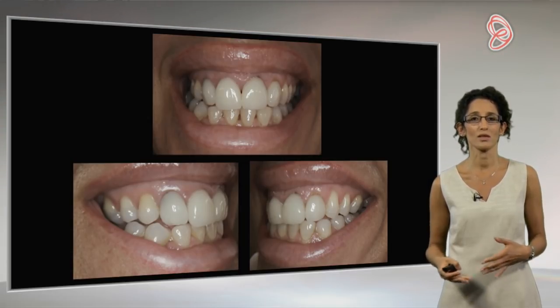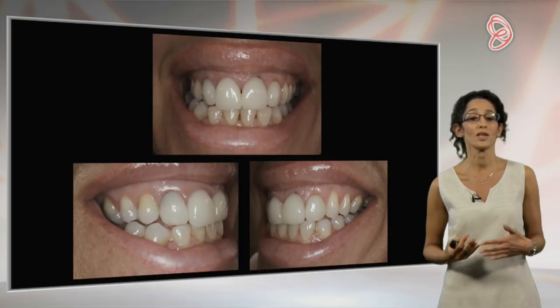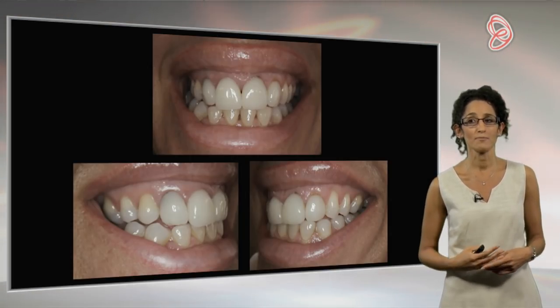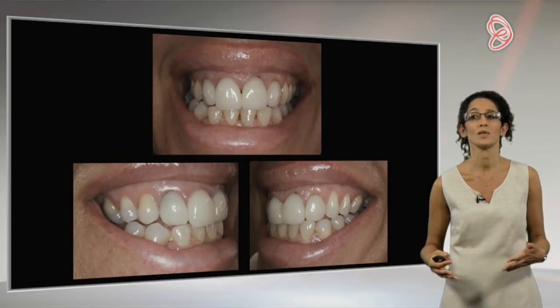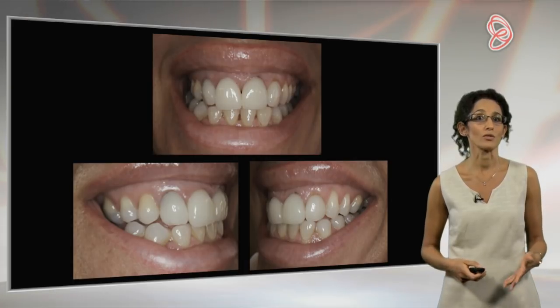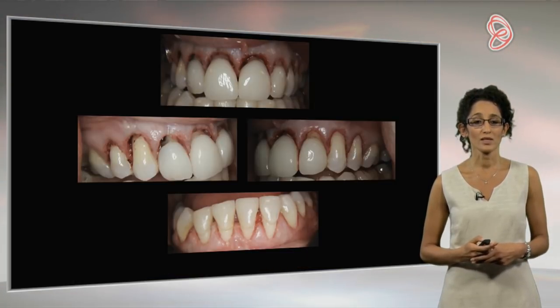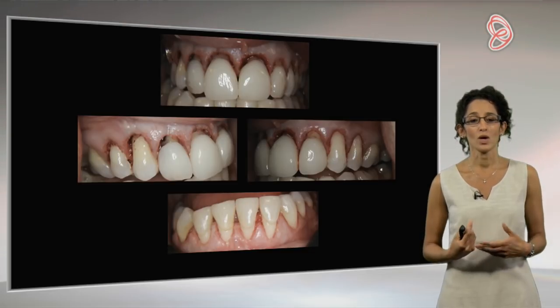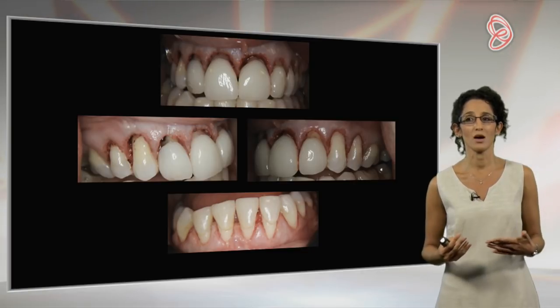So I suggested to her, why don't we use that canine as a reference point, level it off, even out all the gingival margins throughout. After we'd done the top, the dentist then suggested we did the lowers as well, and ultimately she wanted to have everything recrowned and reveneered for a more cosmetic smile. So that's exactly what we've done. So remember, we're using a hard and soft tissue laser. So this is it immediately after treatment.